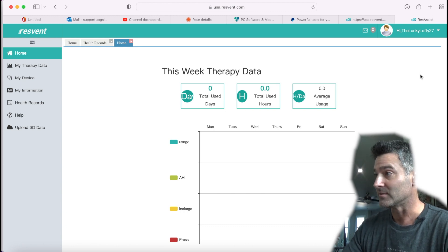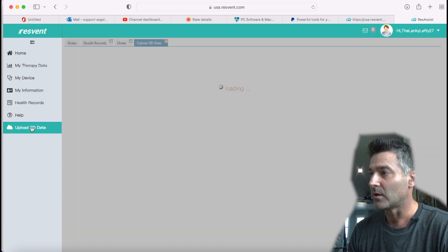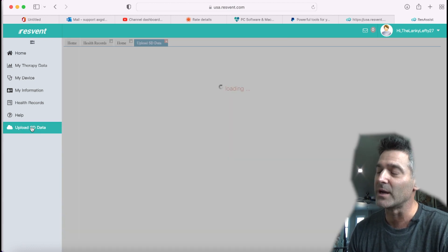I already have the SD card in there. It's showing nothing. But if I go into upload SD card, let's see what kind of information we can get. If there's detailed leak data throughout the night, that's really what I'm looking for, as well as breath-by-breath information. I want that kind of detailed information. If we can get that, we're solid.